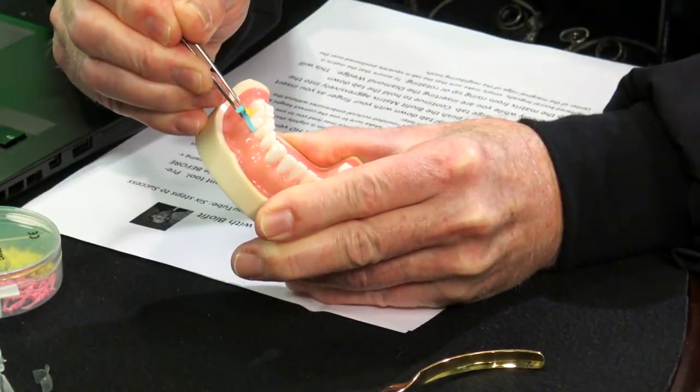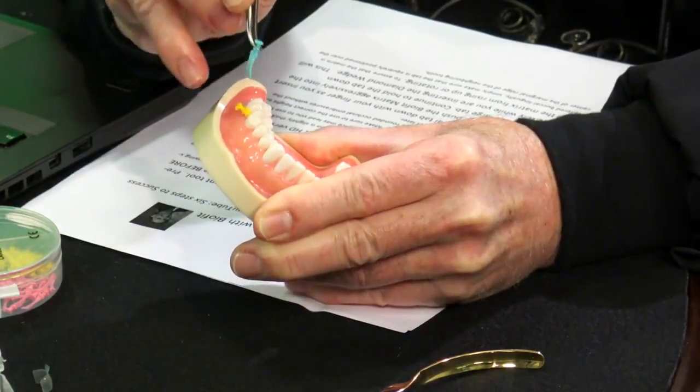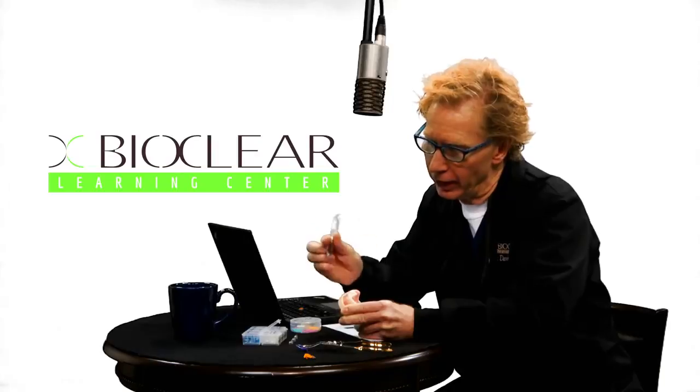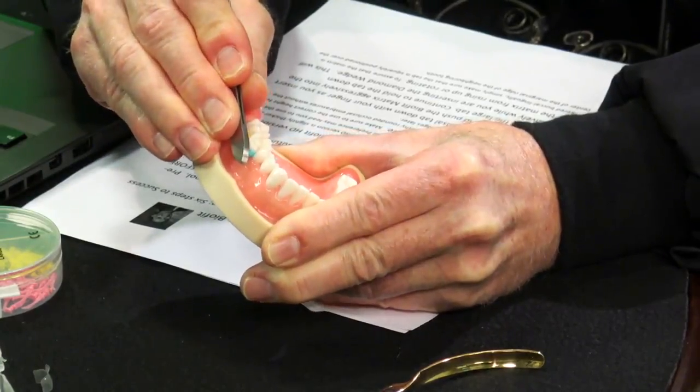It doesn't go through the soft tissue — it obviously goes on top of the soft tissue. You'll notice I'm coming in at a 45-degree angle under the contact to do the pre-wedge, and then use the other end of the special cotton pliers to push on the wedge and give it one last little push.